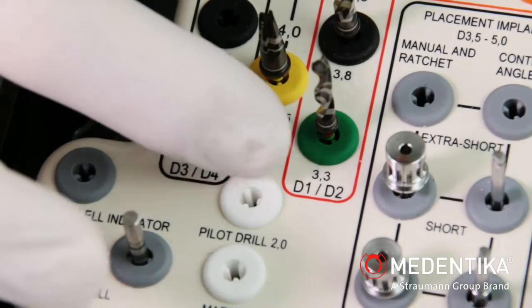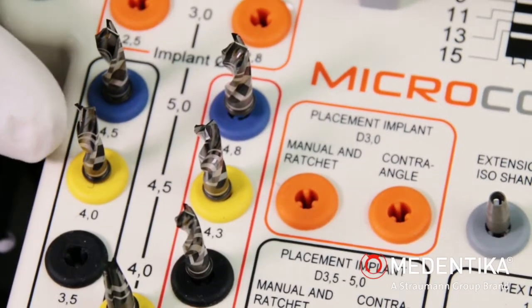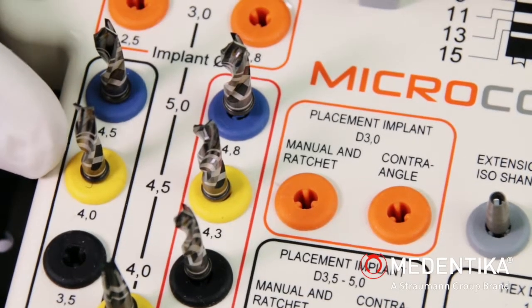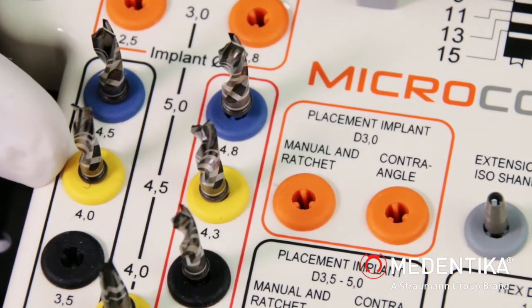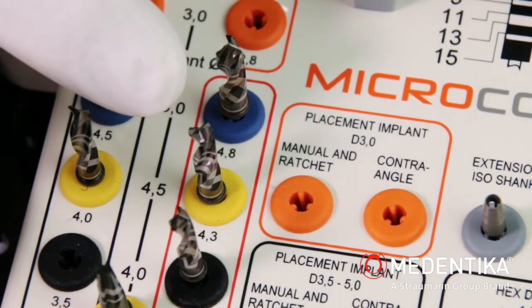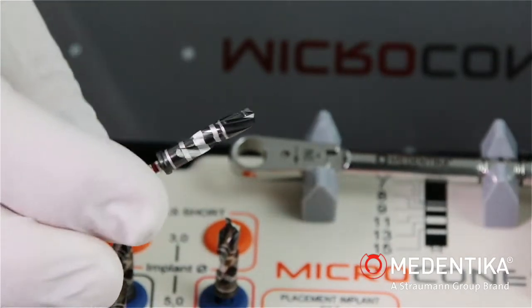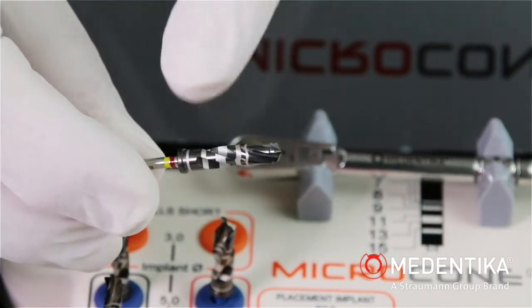Final depth drilling is normally completed using a standard drill 4.0 mm yellow ring. In our case, there is an extremely compact cortical bone. We are therefore using a cortical drill 4.3 mm yellow-red ring.